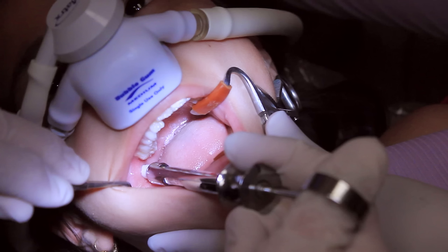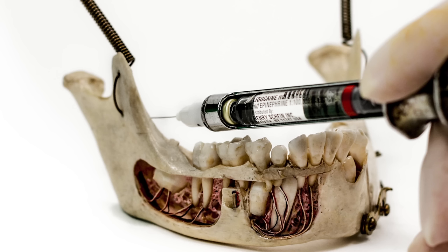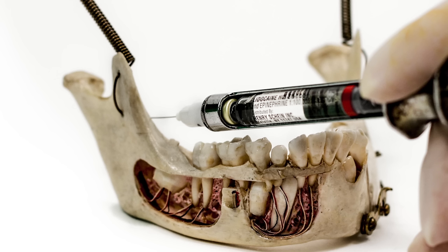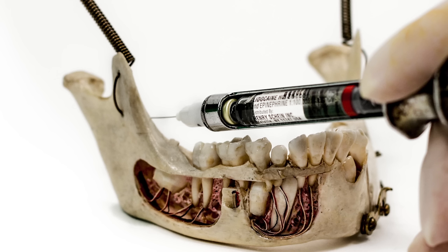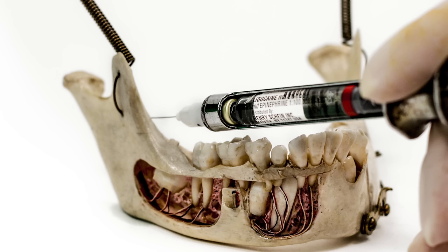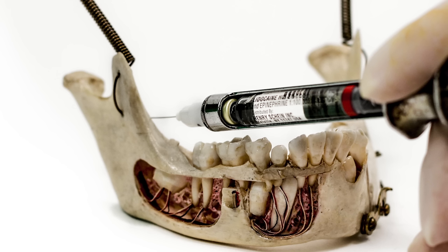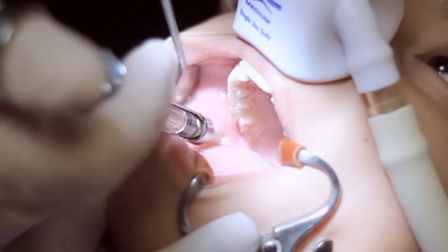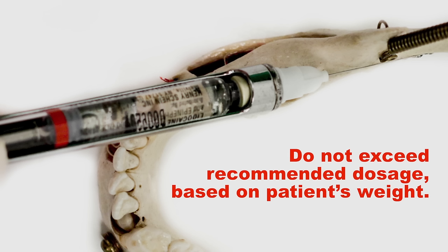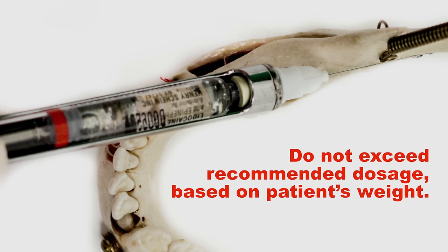Using your mirror to retract the cheek, and with the assistant holding the bottom lip below the central incisors to avoid any pinching of the lip, enter the mouth with the syringe edge parallel to all of the teeth in the arch, keeping an equal distance from the occlusal surface of the posterior teeth and the incisal edge of the anterior teeth, keeping parallel with the ridge. With a single smooth motion, allow the full length of the needle to penetrate the retromolar pad area at the top of the triangle.